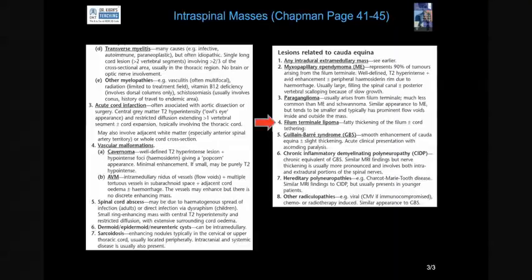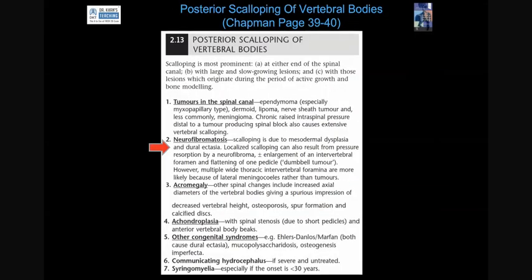They will remove the connection with that lipoma, and the patient will become better. Second thing in this case, which candidate 2 did well, was the stigmata of dural ectasia.